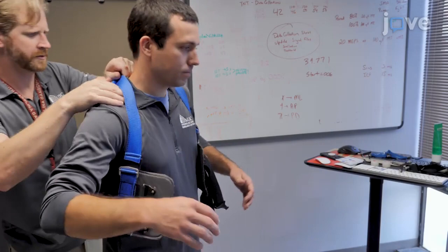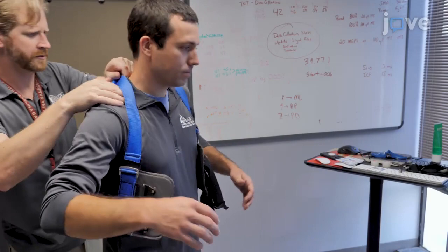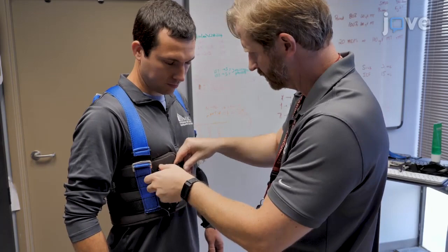Once the force plate is calibrated, the participant has been registered to the image guidance system, and the SEMG electrodes have been placed and tested for signal quality, then fit them with a safety harness.